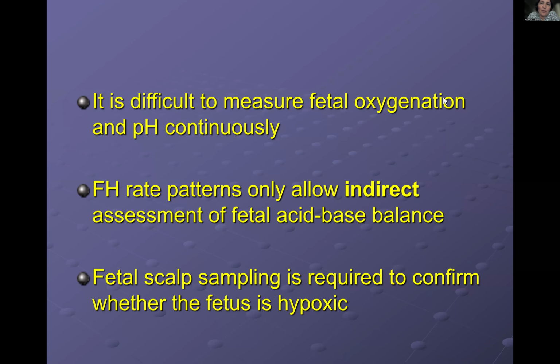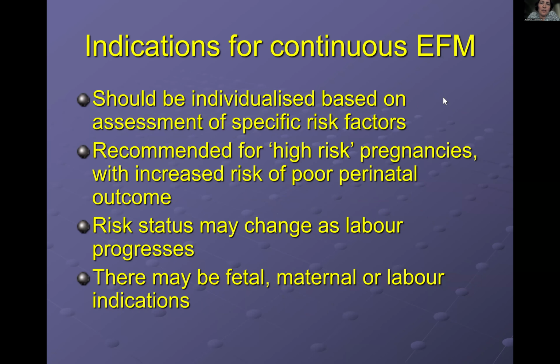And therefore, electronic fetal monitoring is an indirect measurement of the fetal acid-base balance, which is a direct measurement of fetal oxygenation.